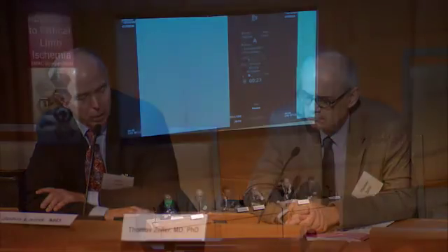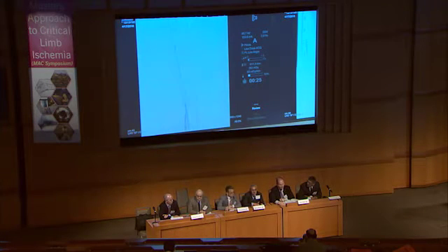So after the first balloon inflation, he didn't really treat all of the disease in the SFA and popliteal, but once he does and there's less resistance to flow, it'll be interesting to see what it looks like. So you would at this point stent the stenotic lesion with a Viabahn and then take follow-up pictures? Well, I'd like to see what it looks like after everything's been effectively ballooned, for one. I suspect the fistulas will still be there, but they'll be less prominent. And then I think we're going to need to do a covered stent.